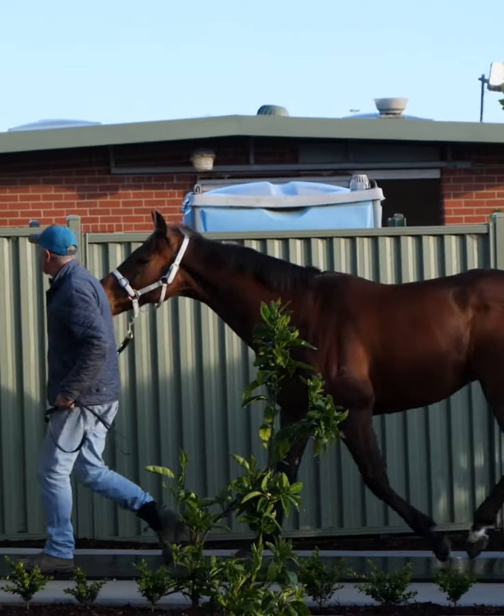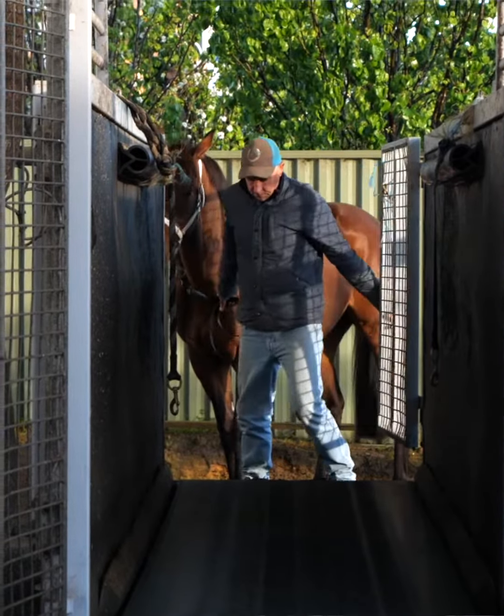Hi, I'm Michael Kent. I'm a horse trainer here at Cranbourne and well-versed in the use of the treadmill in relation to exercise and rehab on horses.